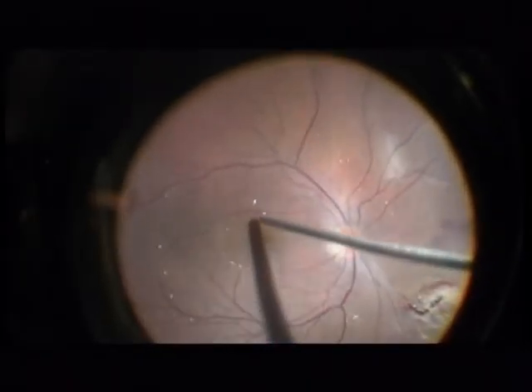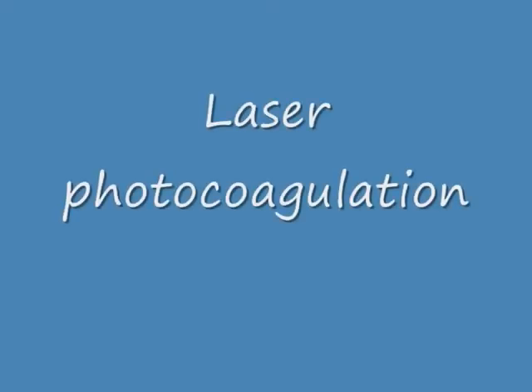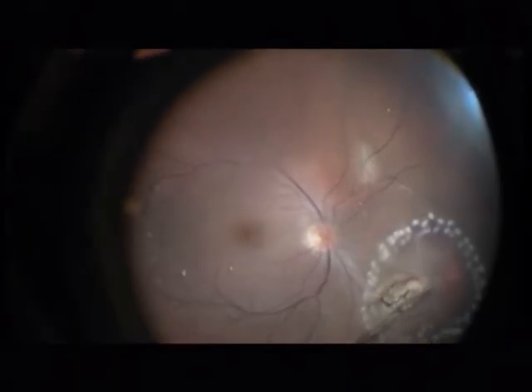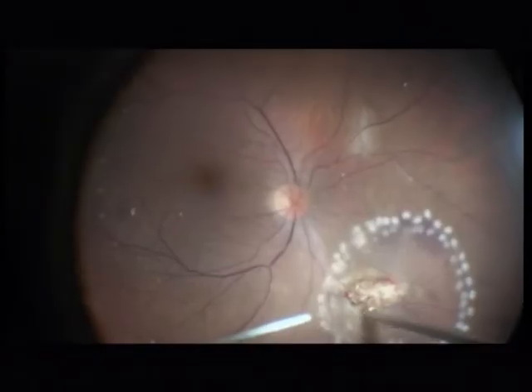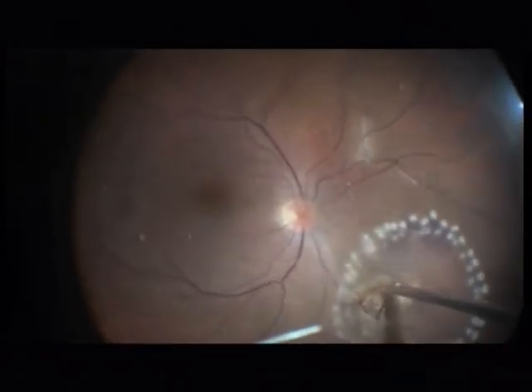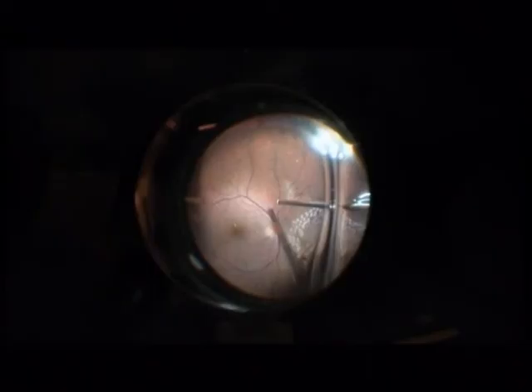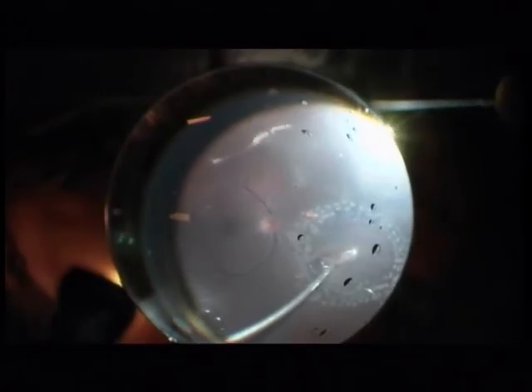So it is time to remove the perfluorocarbon — it is not needed any more. Now comes laser photocoagulation. I am doing a big circle because the tissue inside the circle is detached. There is a focal detachment in this area, so I am trying to push the tissue back into the wound. Continuing with a fluid-air exchange and aspirating the fluid from this focal detachment.